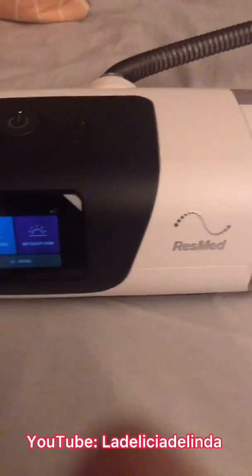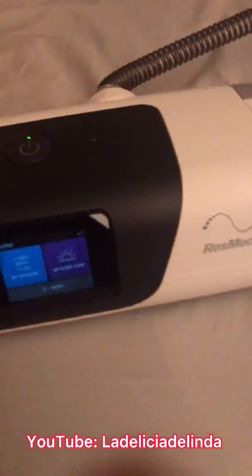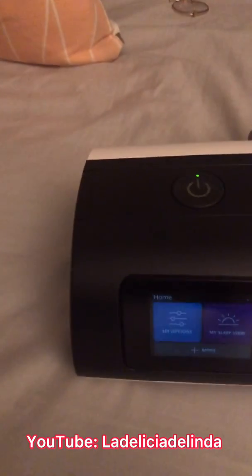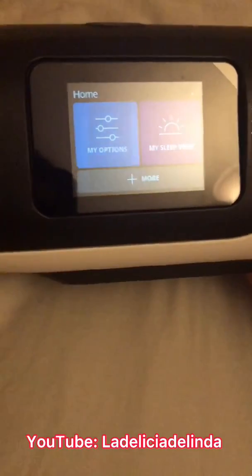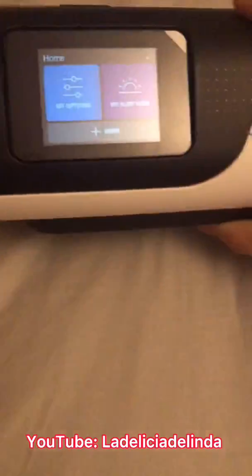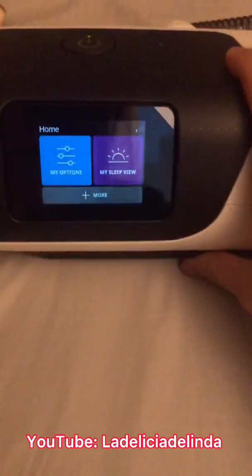Hi everyone, this is Linda and I'm showing you my new AirSense 11, the latest CPAP from ResMed. This is going to be a quick video about how to access the clinical settings. Normally with older machines you press the home button and the knob, but because this is completely touch screen there are no knobs.